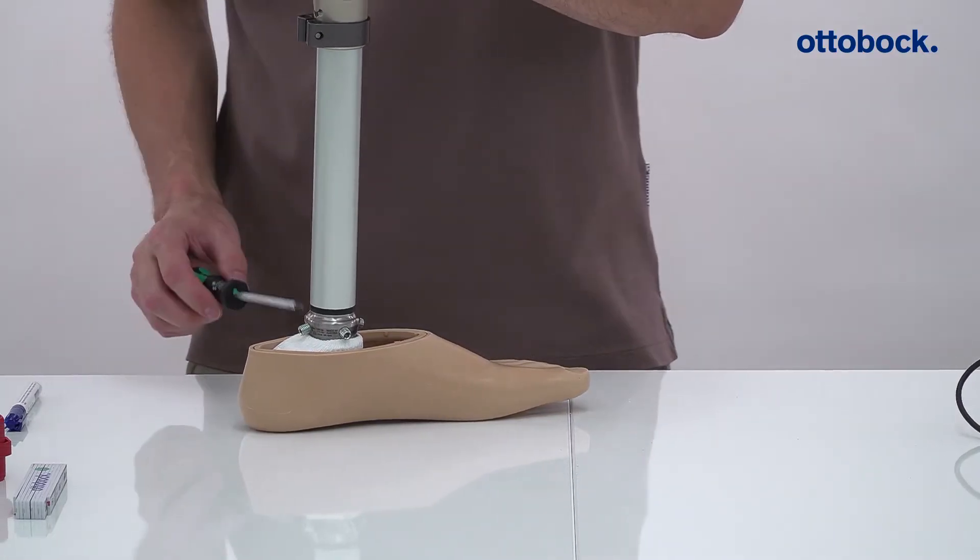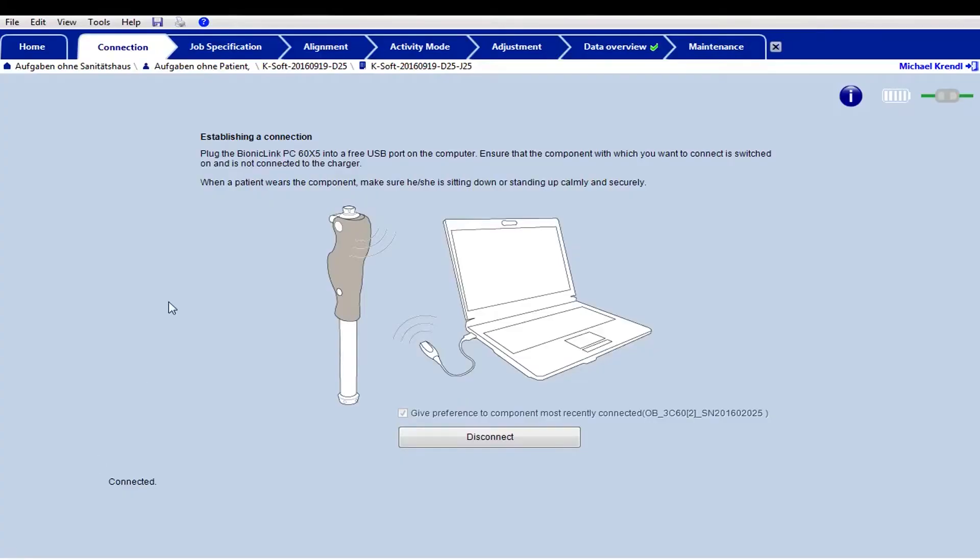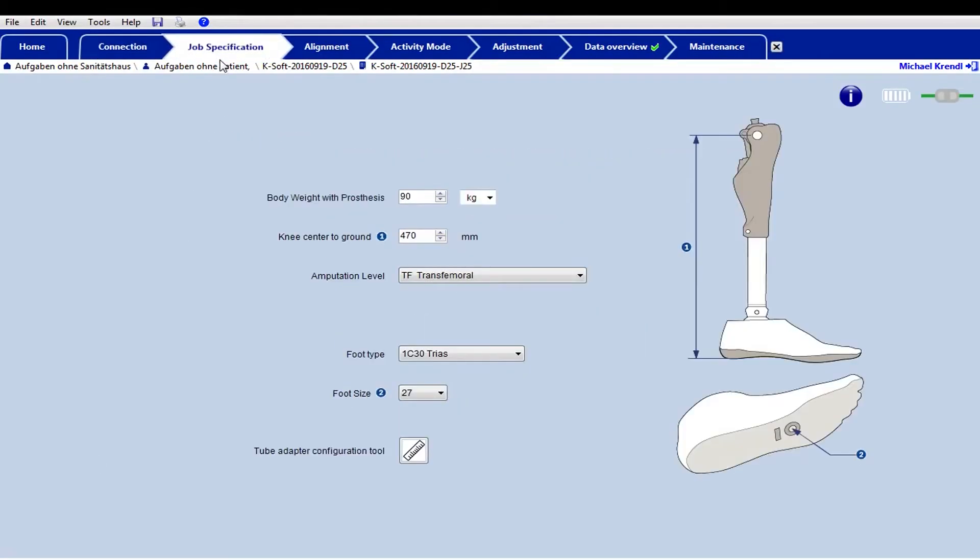Install the foot and calculate the difference compared to the desired length. Alternatively, you can also use the tube adapter configuration tool in the KSoft software.